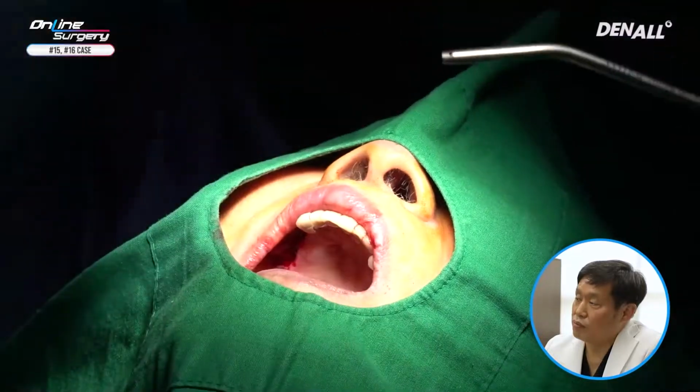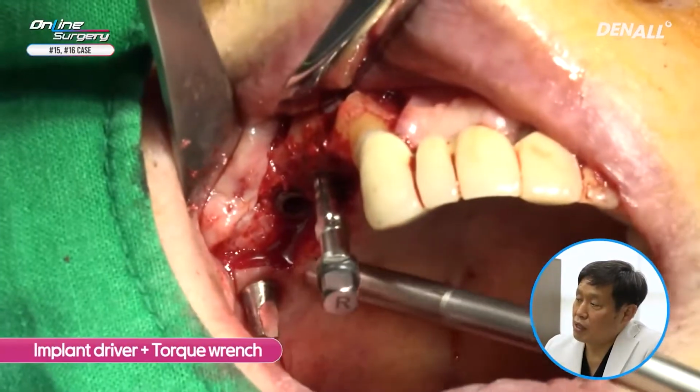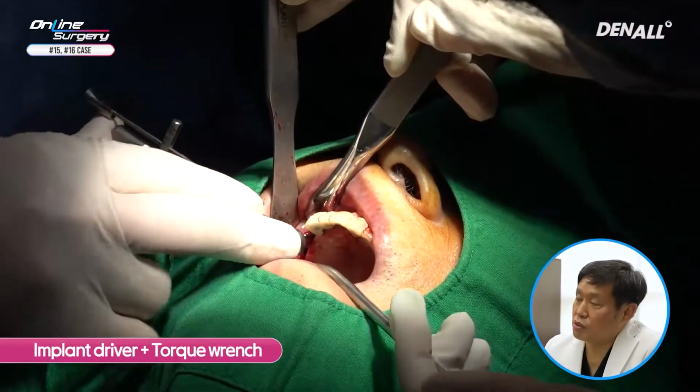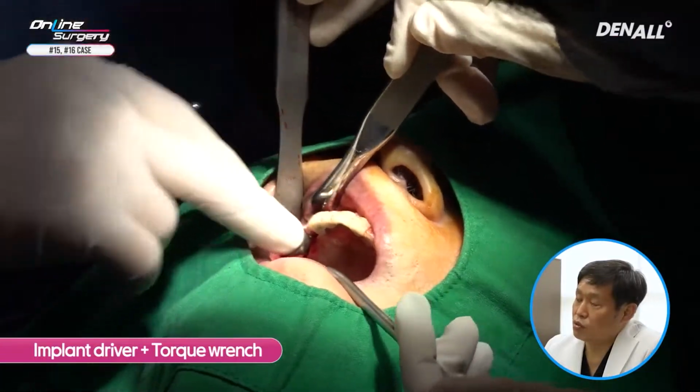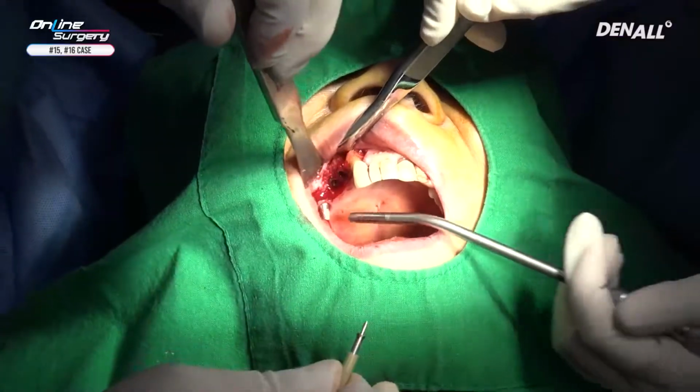Pre-mount is removed. Implant driver is used to get the final position. Once again, you check the position. You try to place it quite deeper. In number 15, there's quite a lot of alveolar bone, so I try to place it deep.